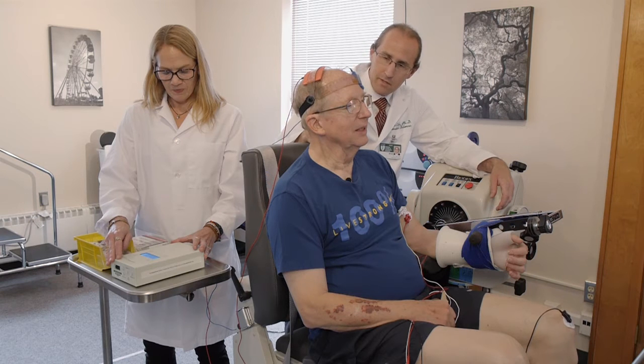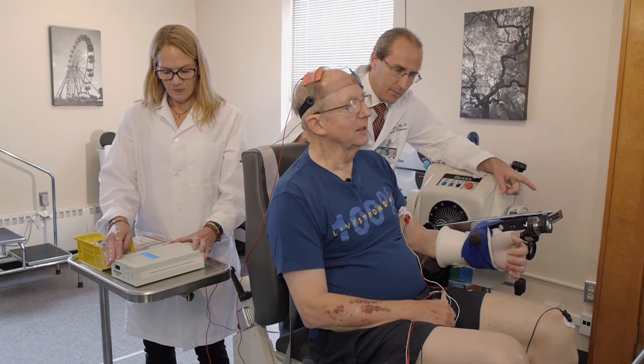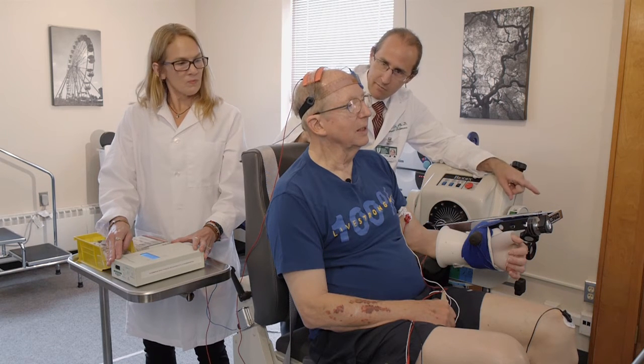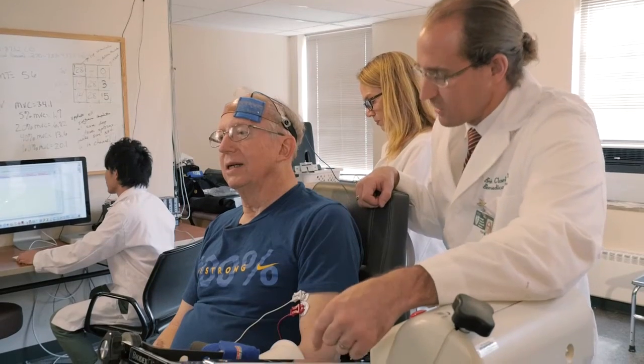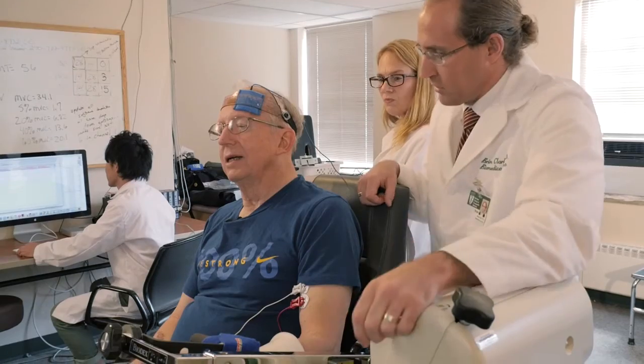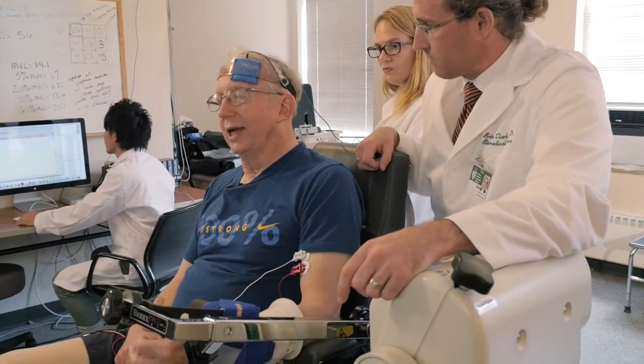We're going to leave this on for about 20 minutes. When we get to 17 and a half minutes from now, 18 and a half minutes from now, and 19 and a half minutes from now, I'm just going to ask you to pull up on this arm as hard as you can.